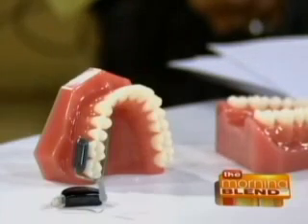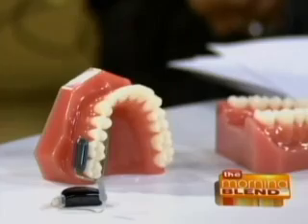Even your forehead, if you stimulate that, you can get that heard down in your hearing nerve. So by us getting a real nice tight fit on her teeth, that sound can just transduce right through her. And the great part is that it's really clear, it doesn't have the distortion that we see with hearing loss when there's severe nerve damage. So they just turn it on, basically, and you can hear.